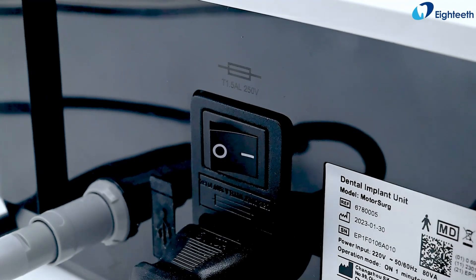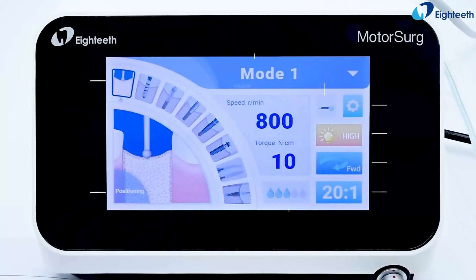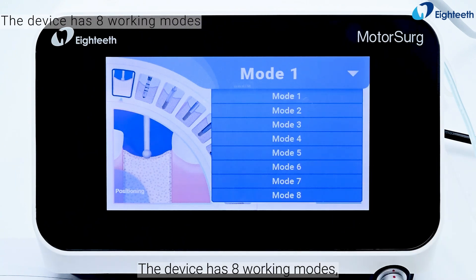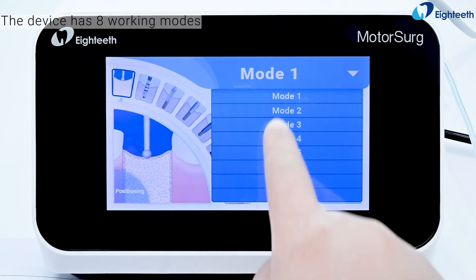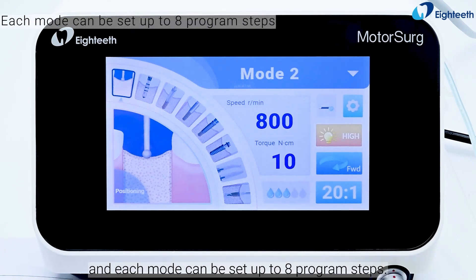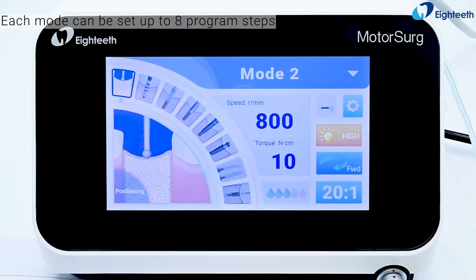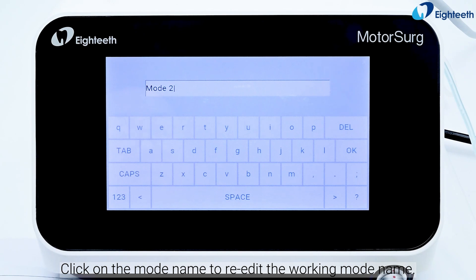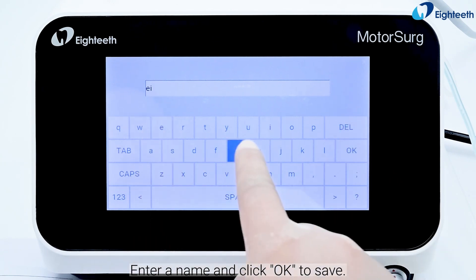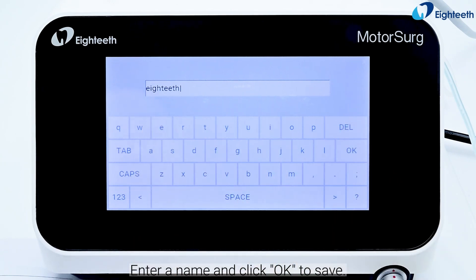Open power button. The device has eight working modes and each mode can be set up to eight program steps. Click on the mode name to re-edit the working mode name, enter a name, and click OK to save.